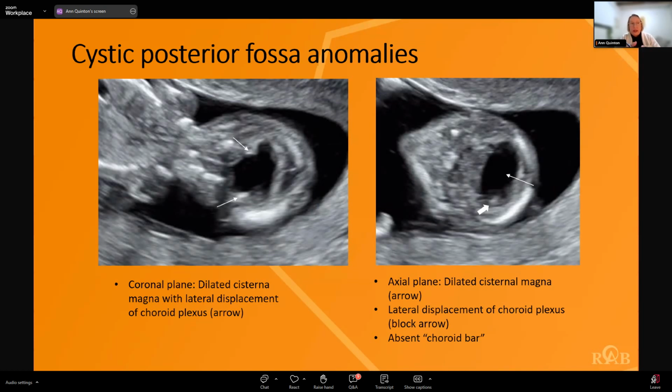I think once they publish those charts, we'll be able to use it as an alternative or in conjunction with the crown rump length for first trimester dating. But they did measure it from outer to outer. I've always measured it from outer to inner. I guess if we're going to compare, like the BPD plane that we use now, people have to measure it in the same way.